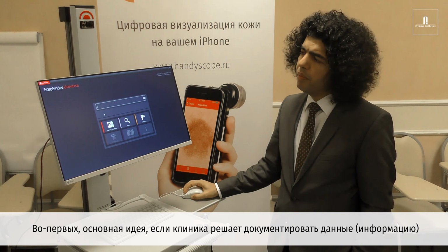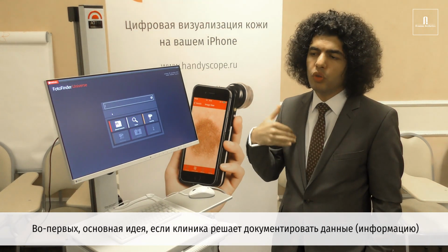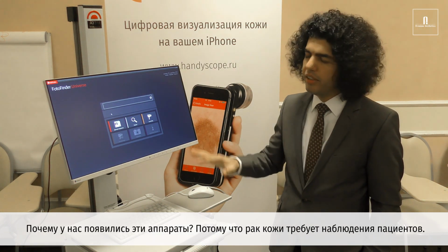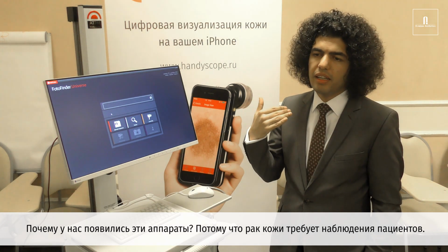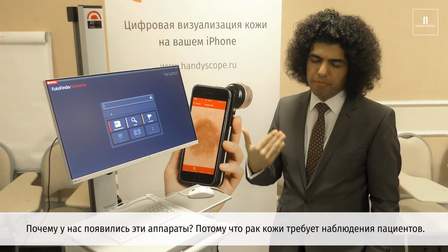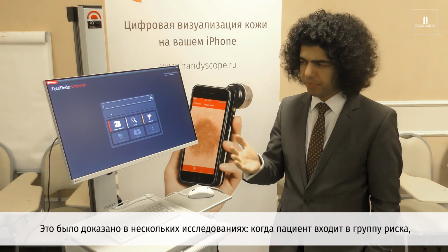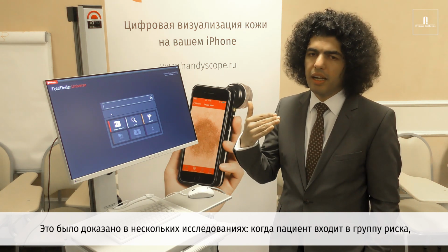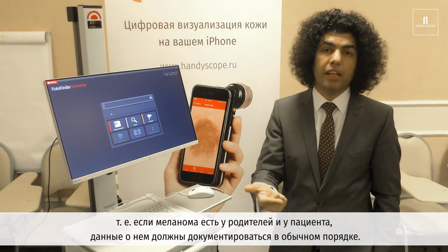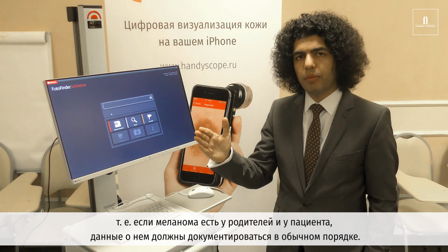In general, the very first point is when a clinic decides to document data, document information. The reason why we have these devices is because skin cancer requires monitoring of patients. This has been proved in several studies. When a patient is part of the risk group, it means parents had melanoma, or the patient had melanoma, this patient must be in a routine of documentation.